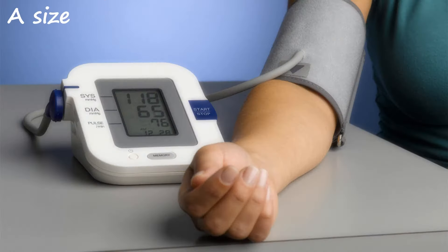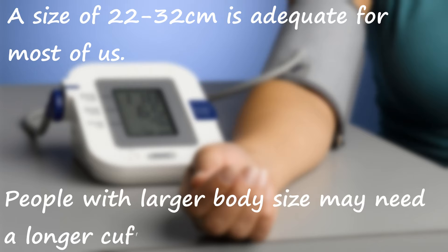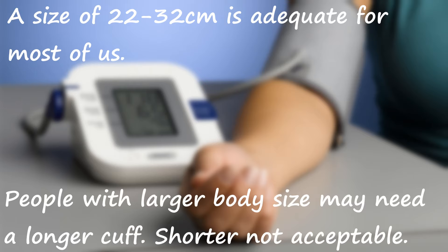If the length given is 22 to 32 centimeters, then this is the adequate size for most of the adult population in India. Even if it is slightly longer than this, that will do. But a bladder length shorter than this will usually be inadequate.